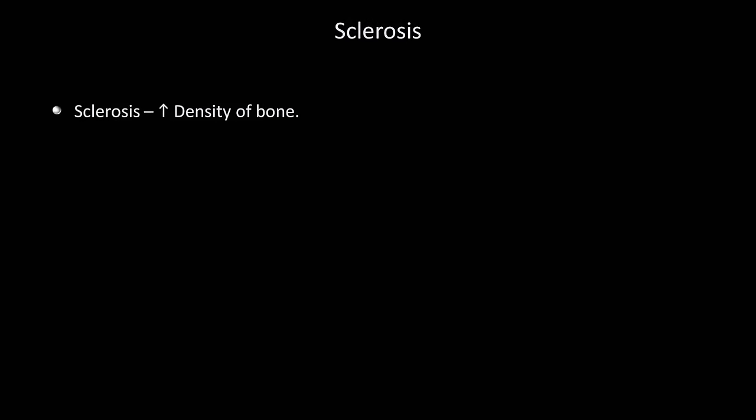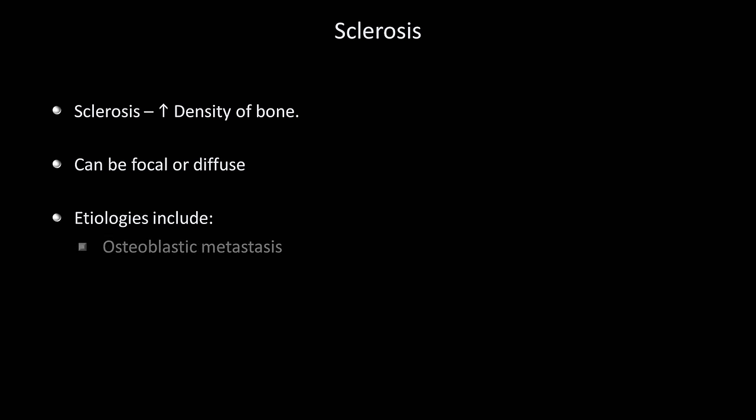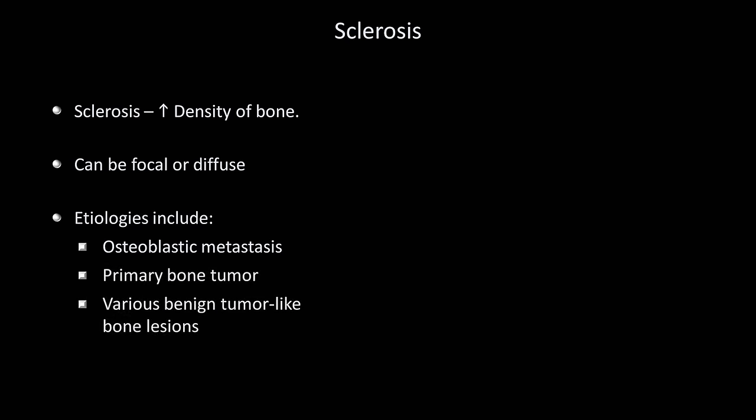Bones can be sclerosed, meaning increased density. It can be focal or diffuse, with numerous etiologies that vary greatly depending upon the age of the patient. Things to consider include osteoblastic metastasis, primary bone tumor, various benign tumor-like bone lesions, Paget's disease of bone, and chronic osteomyelitis. Sclerotic bone lesions are one time when I always consult a radiologist, because differentiating the various possible etiologies based on radiographic appearance is a very subtle art requiring radiologist-level experience.